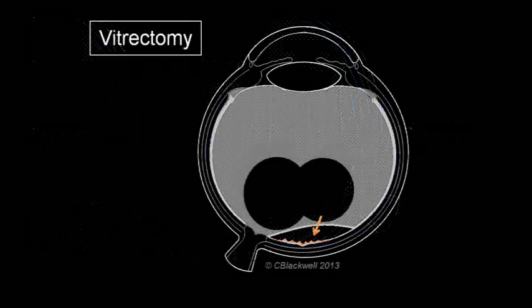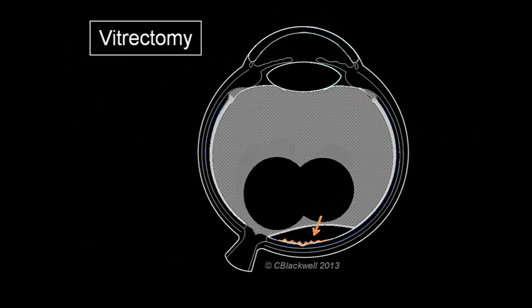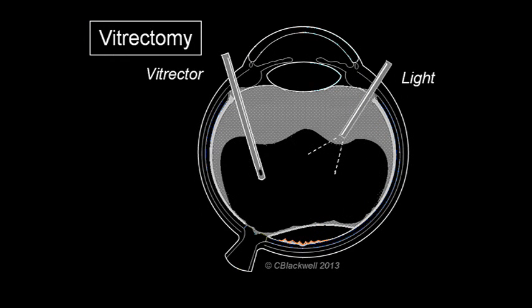In the eye with the wrinkling caused by the epiretinal membrane, once again the central vitreous is removed, allowing access to the membrane on the surface of the retina.